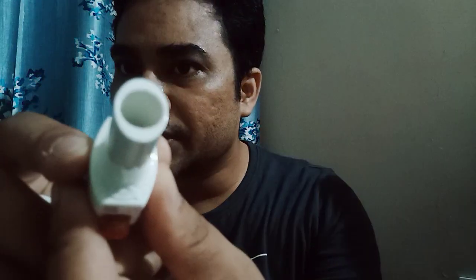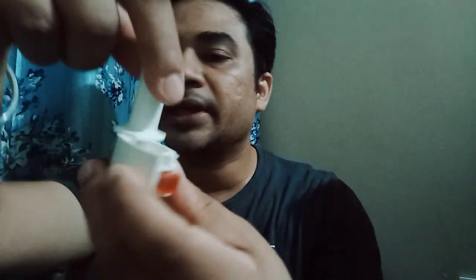I am not getting the angle. Now you can specifically see there is an arrow, and it is pointing this side. As it is pointing, you just tilt it to this side and it opens. So this arrow you have to find very carefully. On tilting, this shifts to this side.